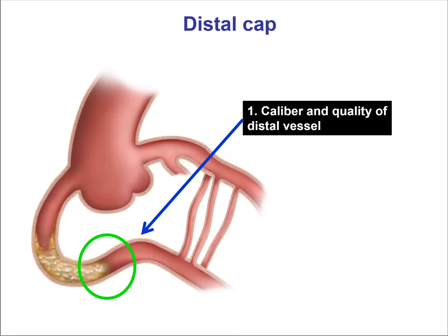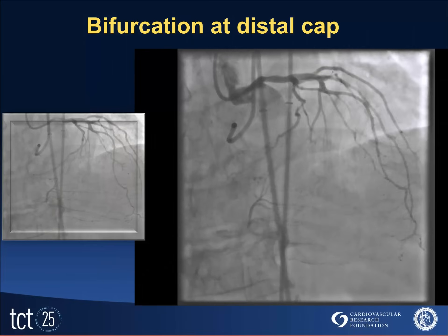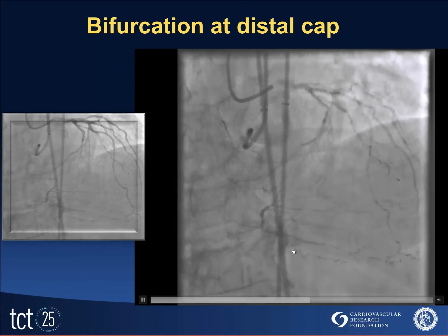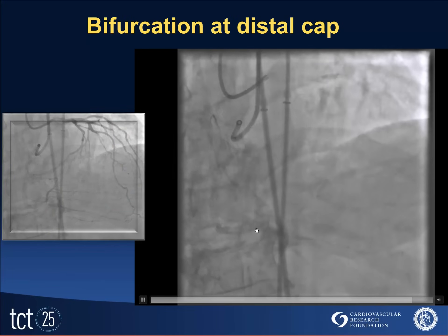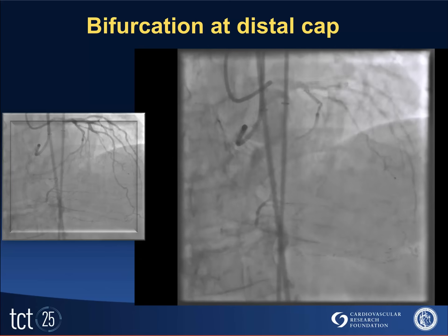For the distal cap, we look at the caliber and quality of the distal vessel. We look at the presence of bifurcations that might result in side branch closure if we go sub-intimally and then re-enter. Finally, we look at any bypass graft and anastomosis sites that might complicate the wire course distally. This is an example of a right coronary artery CTO with reconstitution of the vessel happening at the distal bifurcation of the PDA and the posterior lateral vessel.